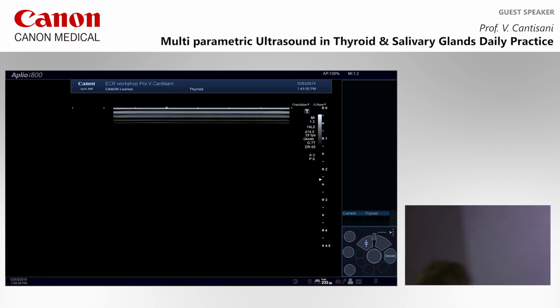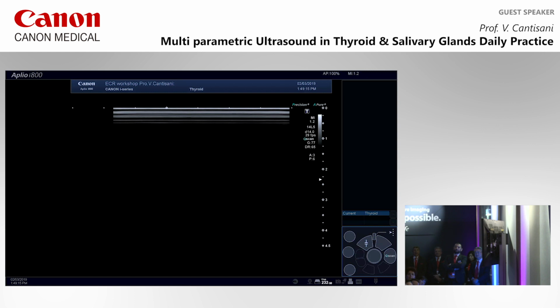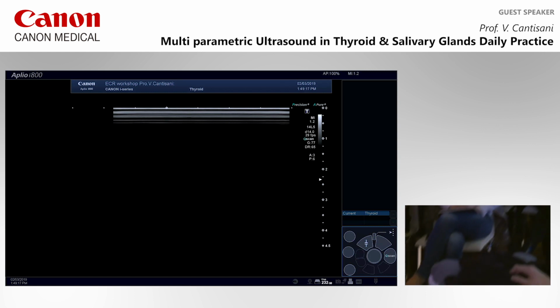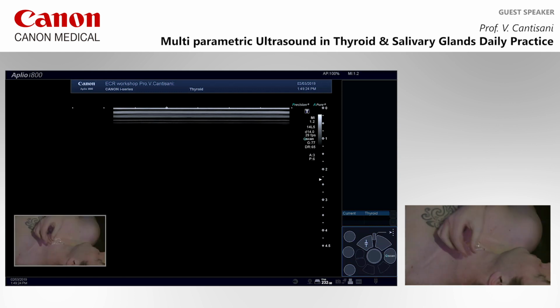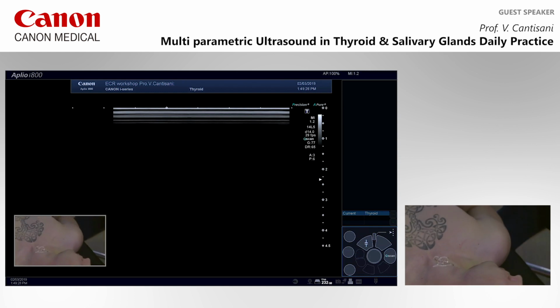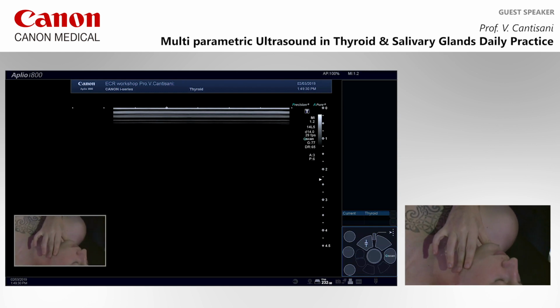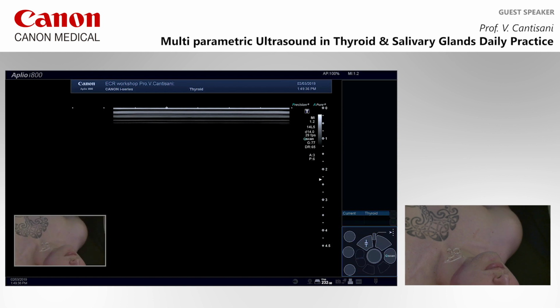So, what I usually suggest is to find the right position. It is important, because position can also influence. Remember, we are looking for stiff representation. If you ask him to do this, but forcing, his muscle will also oppose our maneuver. So, gently, kindly, putting him in the right way. Could you please turn up? Thanks. After that, start with your probe.